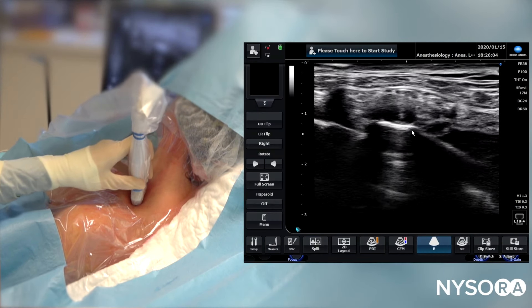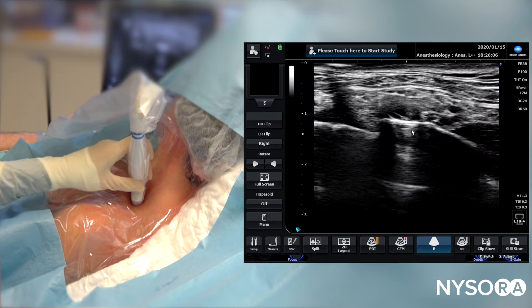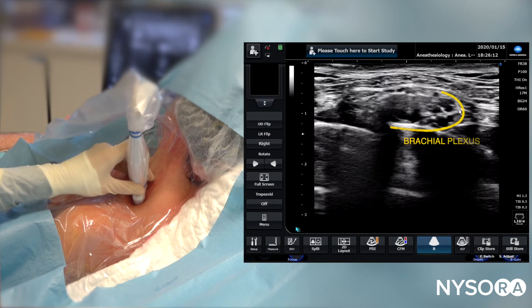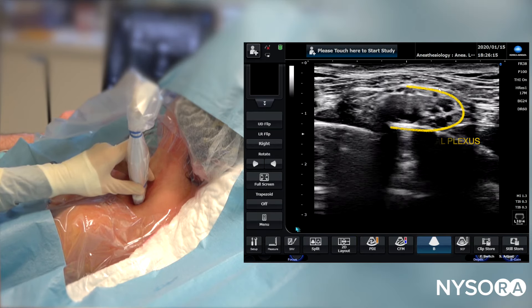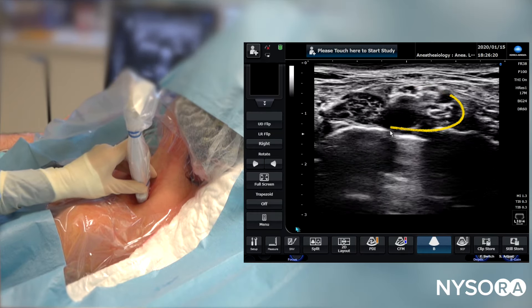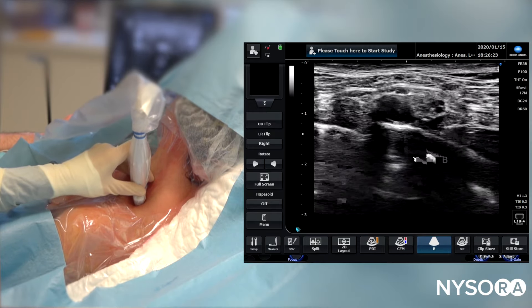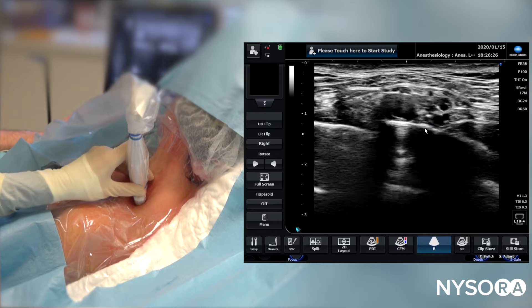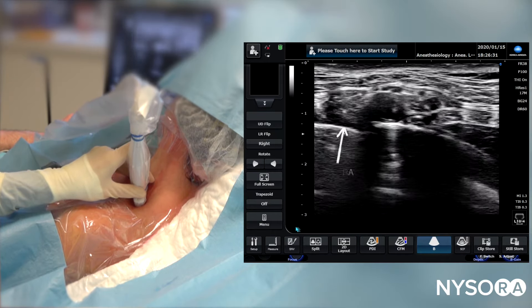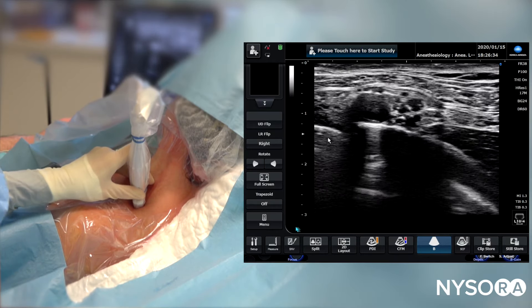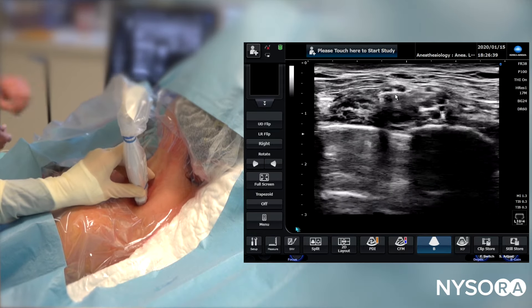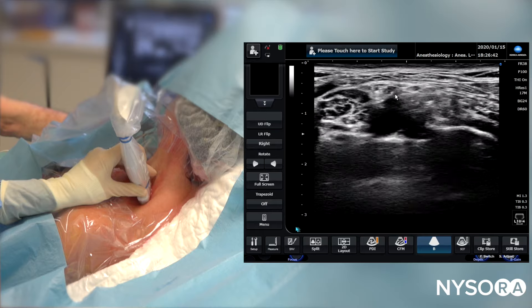We're going to perform a continuous interscalene catheter. Here we can see the subclavian artery and a very nice image of the brachial plexus with the sheath around it — superior, middle, and inferior trunks are all visible. Here we can see the first rib because there's no shadow underneath, whereas here we see the pleura because we can see the appearance of lung structures underneath.